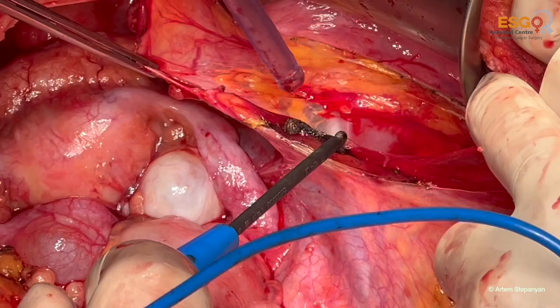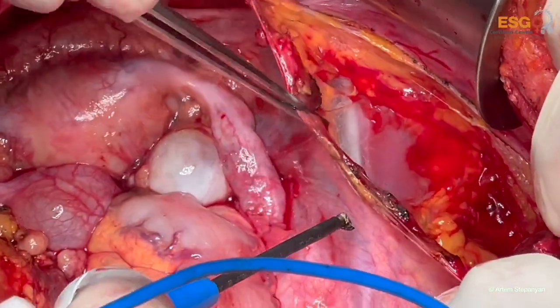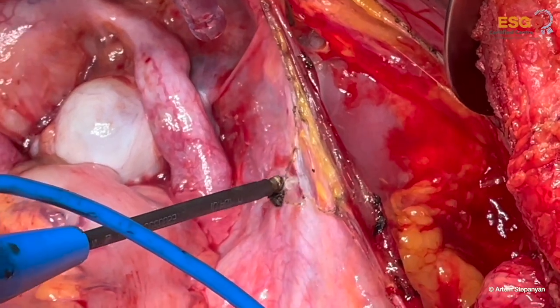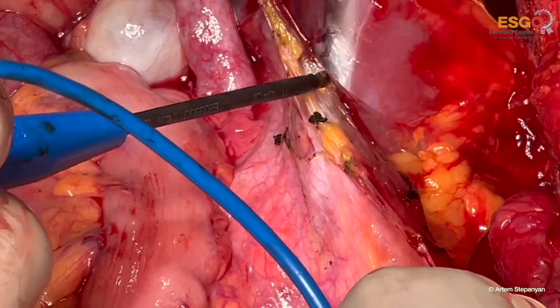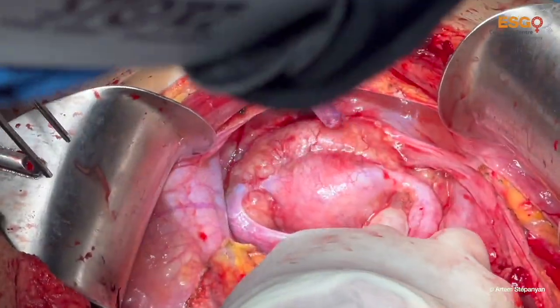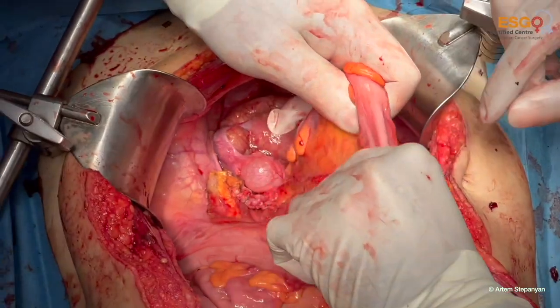Now I incise the peritoneum covering the IP ligament, so that, isolating the vessels of the IP ligament, the gonadic vessels. In this situation, those are ovarian vein and ovarian artery. Here we see the uterus, the infiltrated bladder peritoneum, both ovaries.